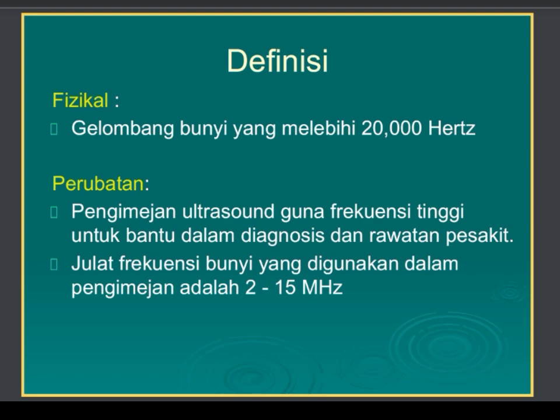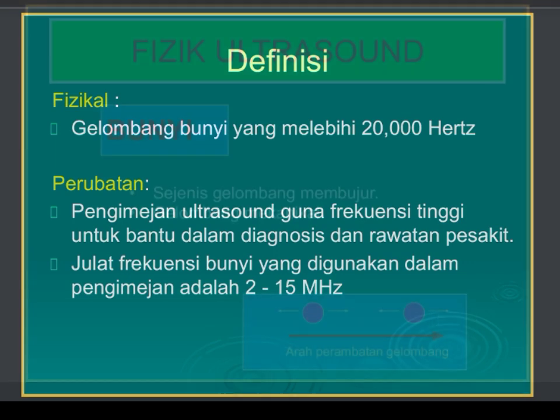Definisi bagi ultrasound ialah pertama dari segi fizikal, ia adalah satu gelombang bunyi yang melebihi 20,000 Hz. Manakala dari segi perubatan ialah pengimejan ultrasound yang menggunakan frekuensi tinggi bagi membantu dalam mendiagnosis dan untuk rawatan pesakit. Julat frekuensi bunyi yang digunakan dalam pengimejan adalah antara 2 hingga 15 MHz.